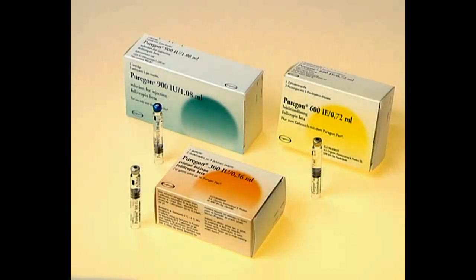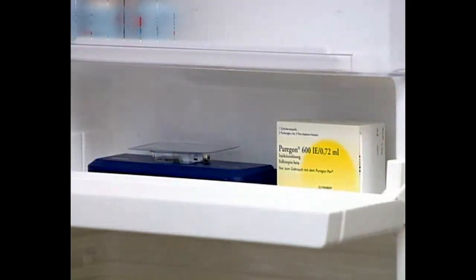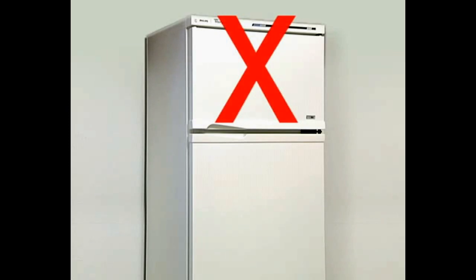Purigone cartridges should always be stored in a safe place. The refrigerator is a good storage place, but please remember to keep the cartridges in the main compartment of your refrigerator, and not in the freezer or icebox.